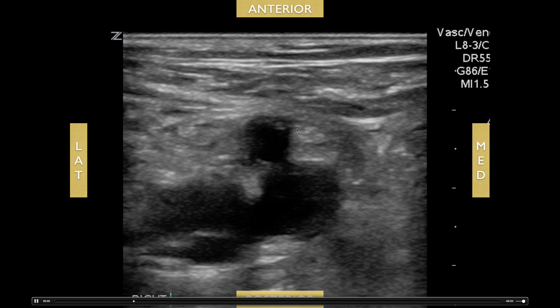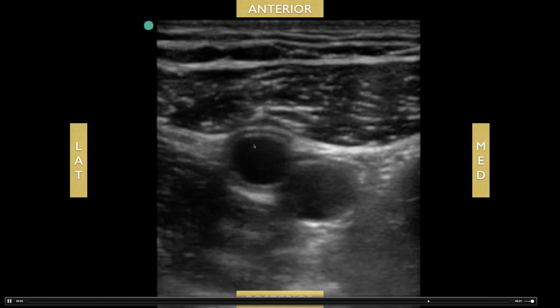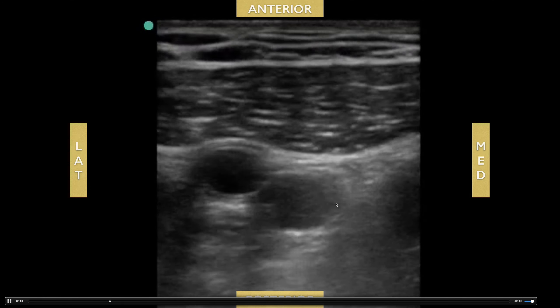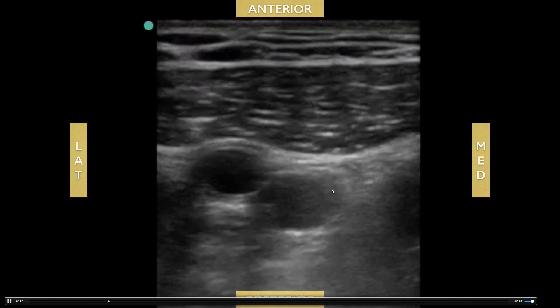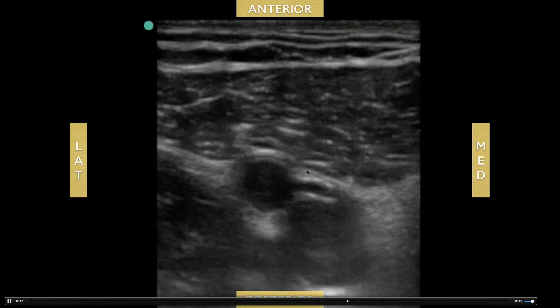Here's another example: the artery and the vein. When you try to compress, the artery is indenting but the vein is not collapsing at all — this patient has a complete clot in this vein. Here's another more subtle example where we're indenting the artery but the common femoral vein is not compressing all the way. Sometimes you won't see the clot, which is why compressibility is so important. Just because you don't see a clot doesn't mean there isn't one — compress it to confirm it's compressible, and if it's not, you have to assume there is a clot there.